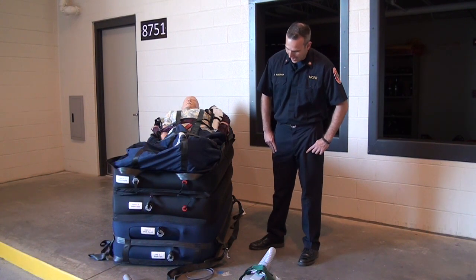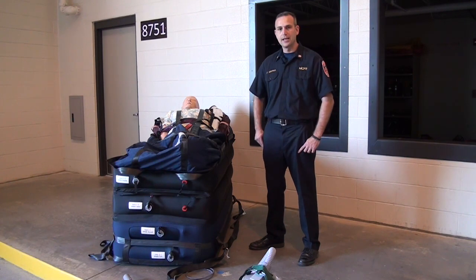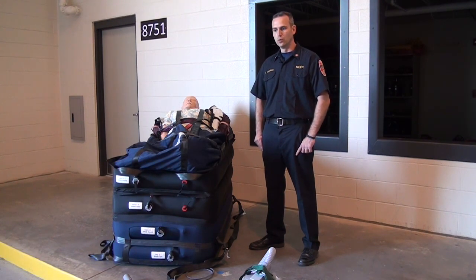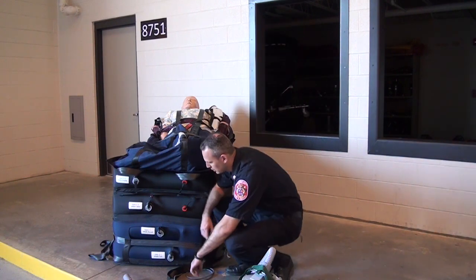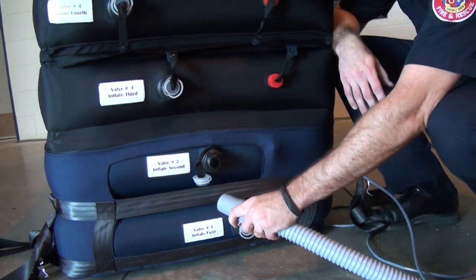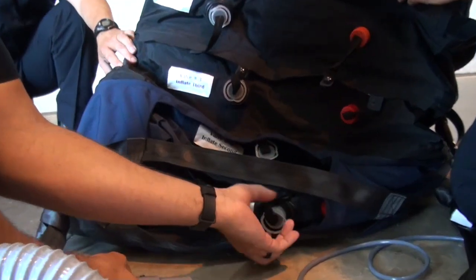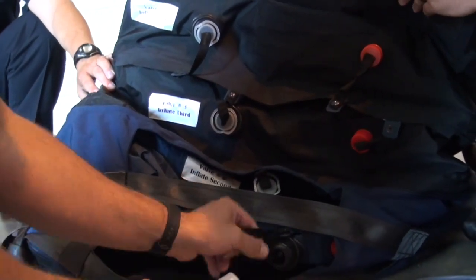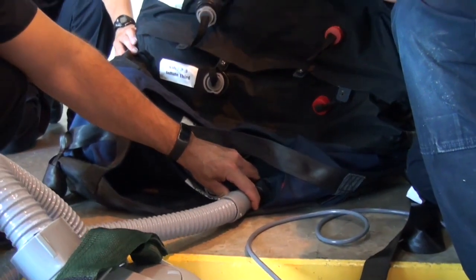The device has four air chambers that are filled with the air pump — the same air pump that we use to inflate the hover mat. Each chamber has to be inflated from chamber one at the bottom to chamber four at the top in order to create stability as we're raising the patient.